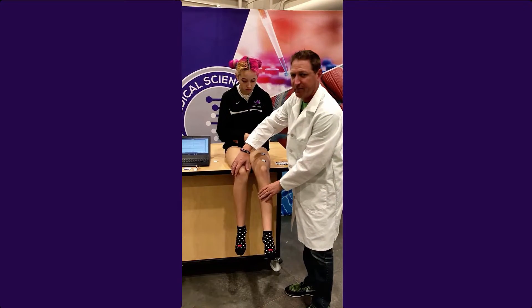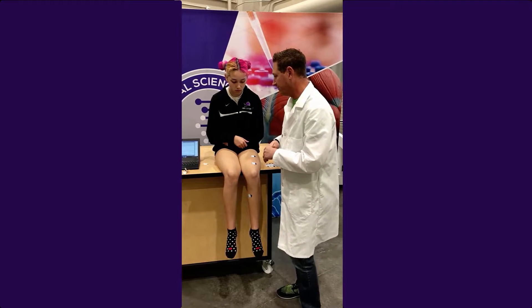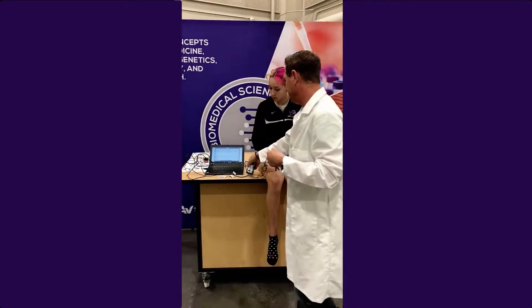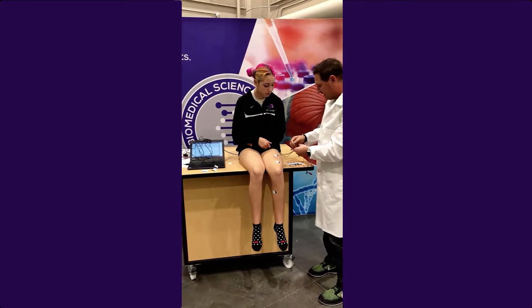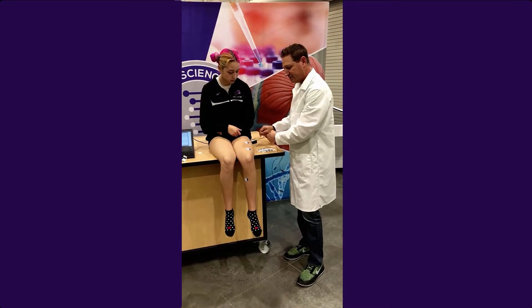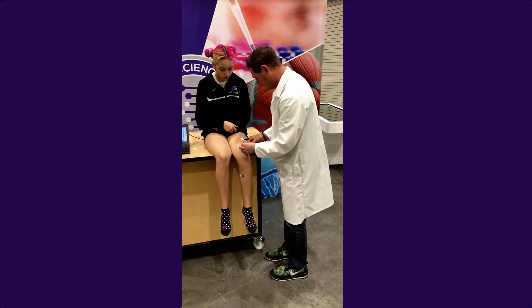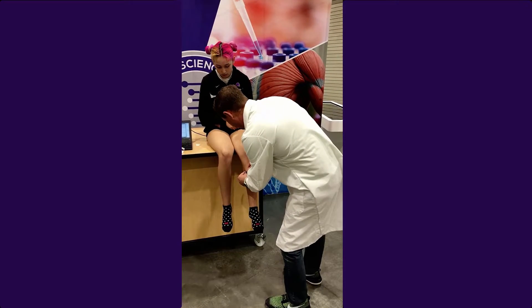The subject is going to be far enough back so that the legs dangle — we don't want the muscle contracted, otherwise there's not going to be a reaction. This first one, we are going to use a voluntary kick. I'm going to take my EKG sensor and set it up; it's going to be the same for both labs. I'll put it behind her so it doesn't get in the way, and I'm going to attach my clips to these stickers. Green and red go up on top — it doesn't matter which one goes to which.